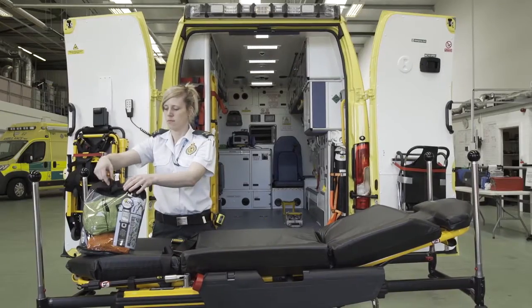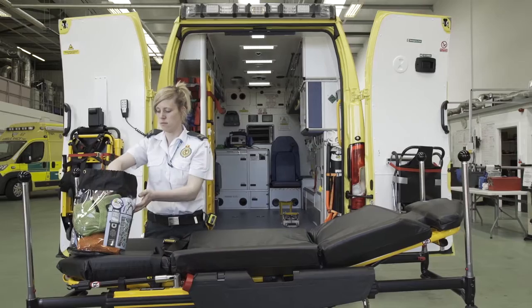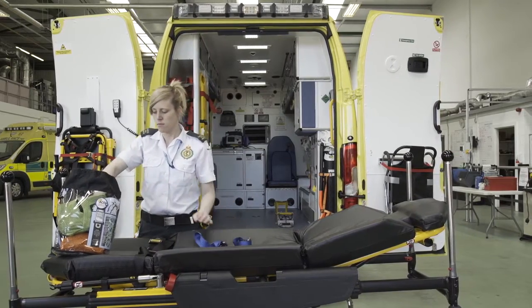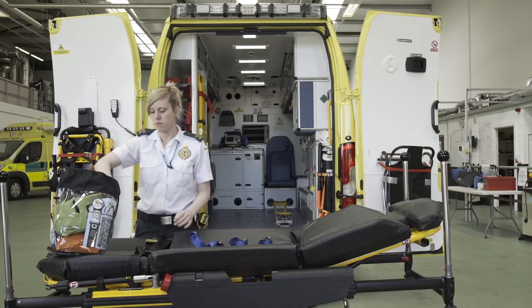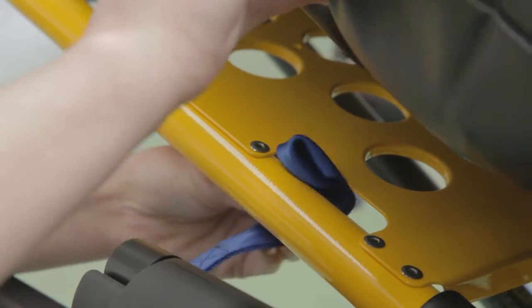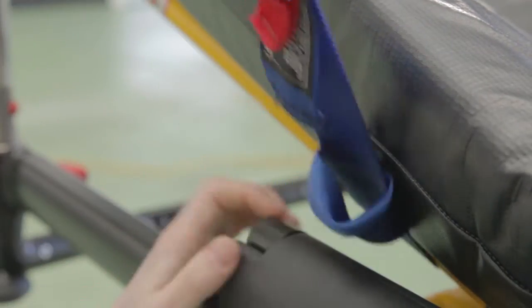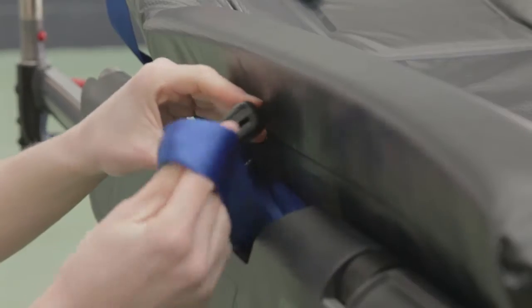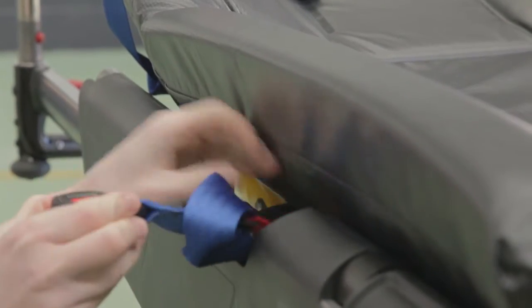The ACR is universally compatible with any cot. First, attach the blue harness straps to the cot frame. Pass the looped end around the frame. Repeat this so that all four harness straps are attached to the cot frame and resting on the mattress.